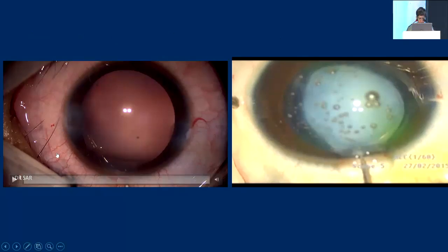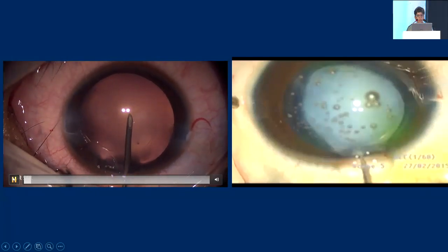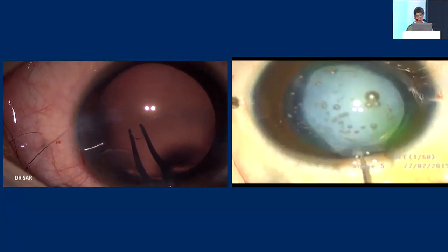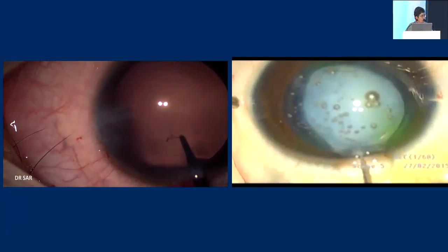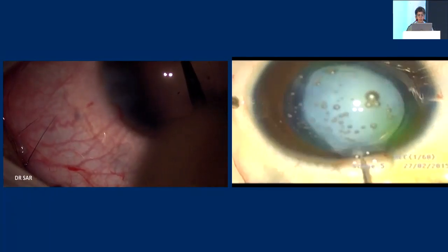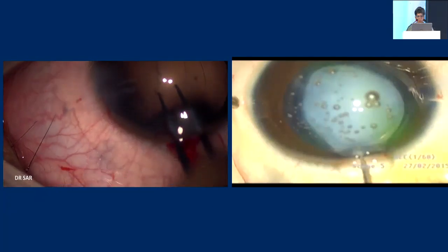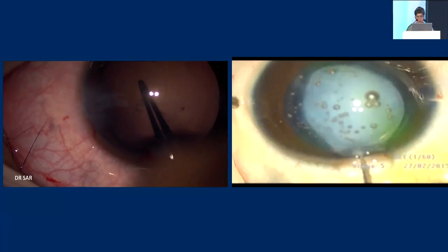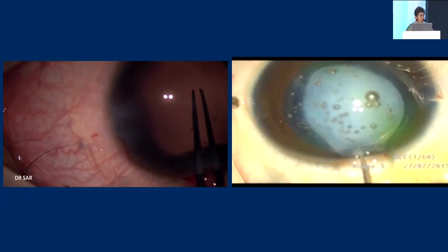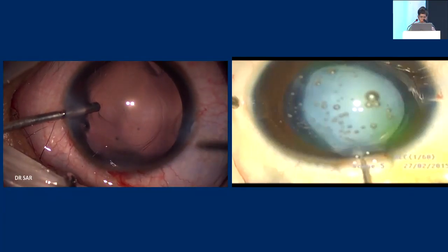Both these techniques compare well with primary posterior capsulotomy and anterior vitrectomy in preventing visual axis opacification. The principles are the same — you make a small opening and use the red reflex, because retroillumination allows you to visualize the flap really nicely against a red background. You don't need staining here because your red reflex acts like a stain. Your forces, again, are applied two to three clock hours at a time — grasp and re-grasp until complete. Posterior capsulotomy is easier than anterior capsulotomy in almost every case.